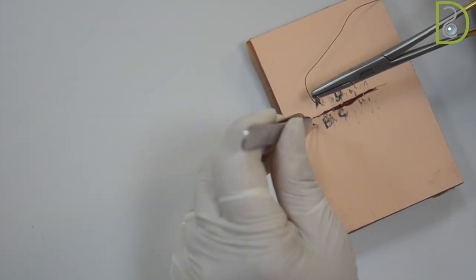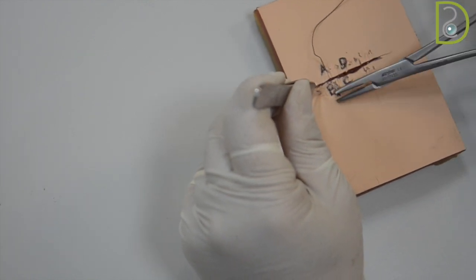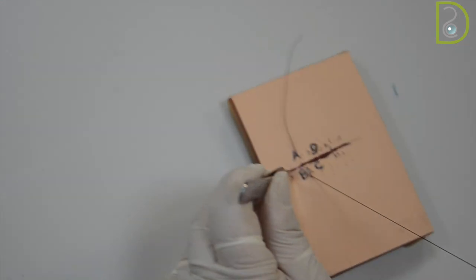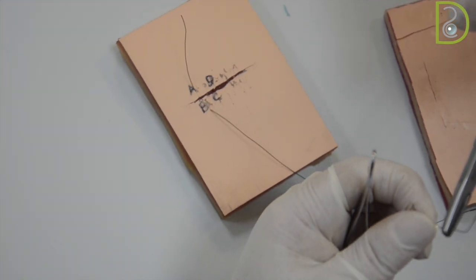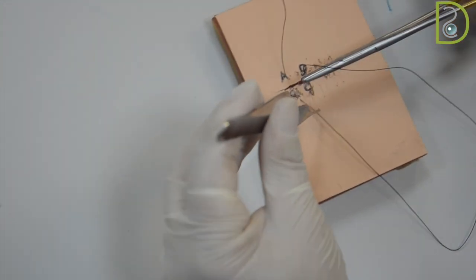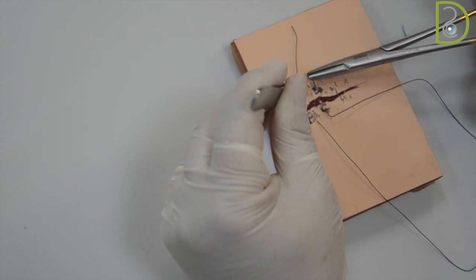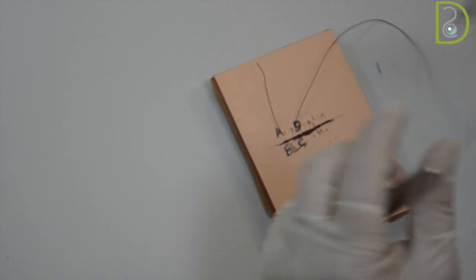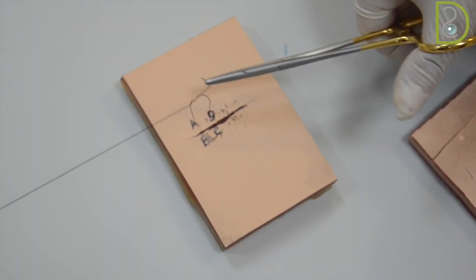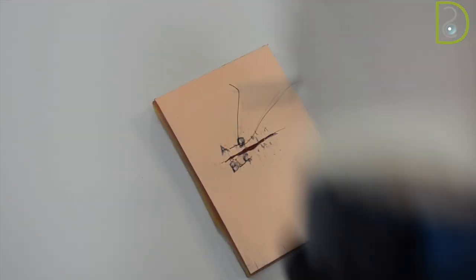Then we will go and penetrate from point A to point B. Keep a little bit of the tail. Then it's going to be point C to point D. This is the first line that will form the second line — one and two. You will hold and then the second line.